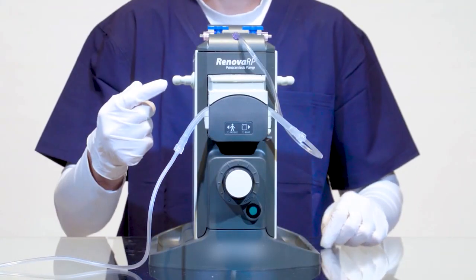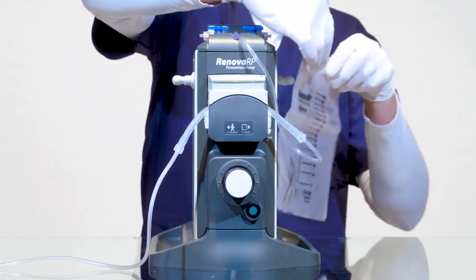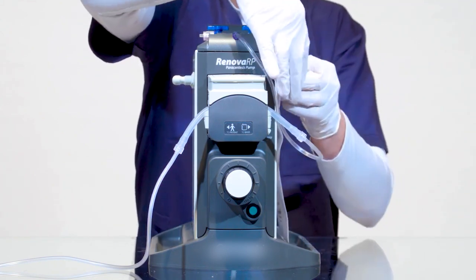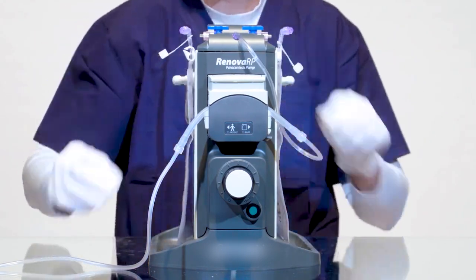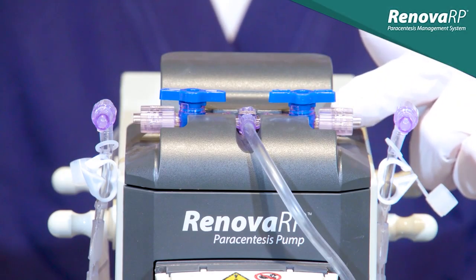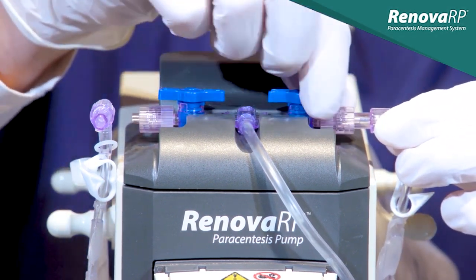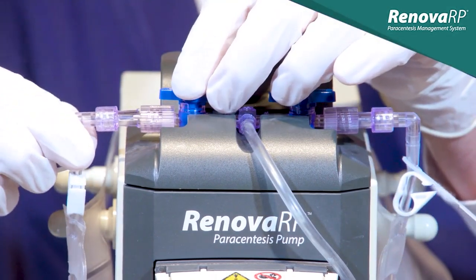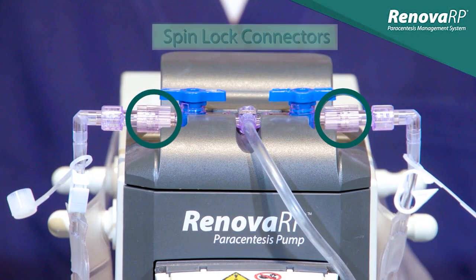With the tubing properly in place, we can hang and attach a drainage bag on either side of the pump. Confirm the white pinch clamp on each bag is in the open position and then hang the bags using the posts on the side of the pump. The bag to tubing connection is very important, so take care to ensure you have firmly connected the bag to the T-connector and that you have tightened the spin-lock connector. One spin-lock connector is tightened clockwise while the other is tightened counter-clockwise. Failure to properly tighten the spin-lock connector can result in the bag disconnecting during the procedure, increasing the risk of fluid exposure.